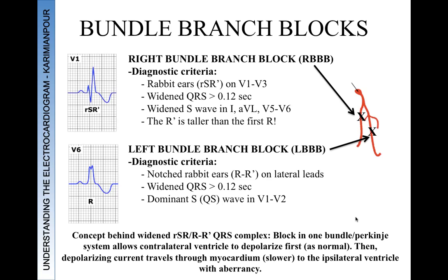All right, welcome back, and this is part 4 of 4 in the ECG series. In this section, we're going to talk about heart blocks and other conditions with ECG findings, and basically some remaining topics that don't really fit in any other section.